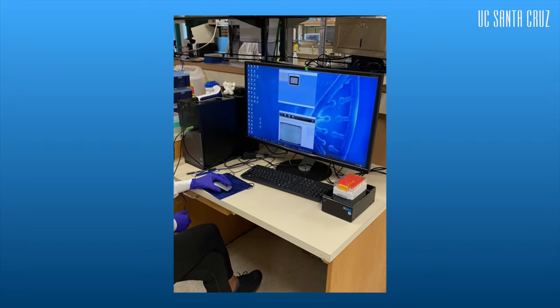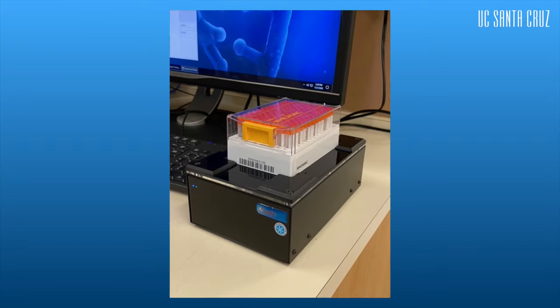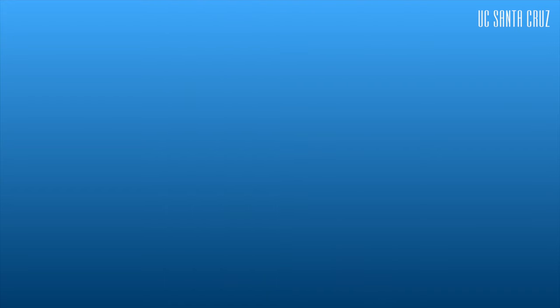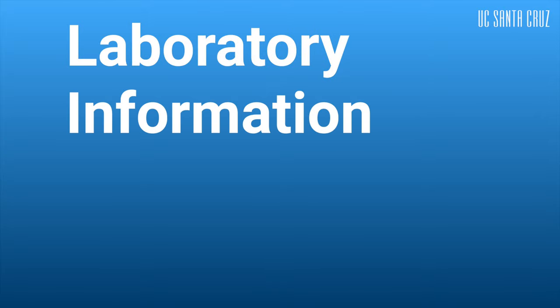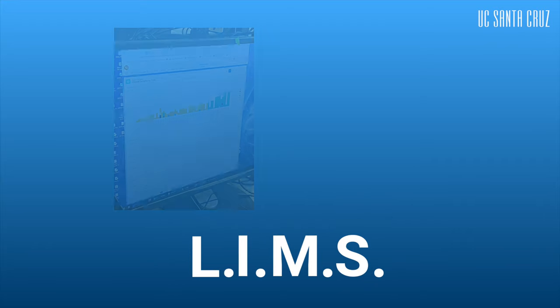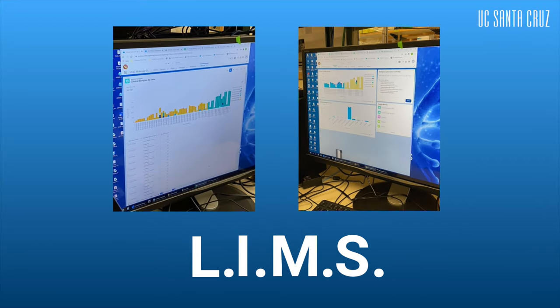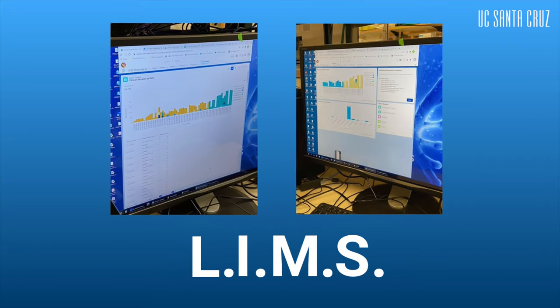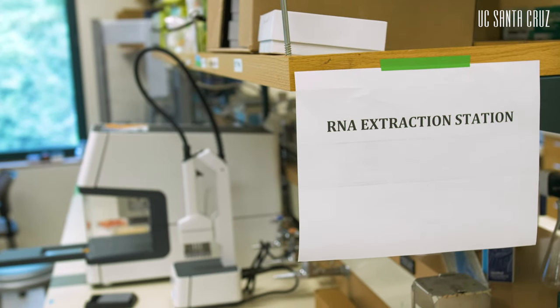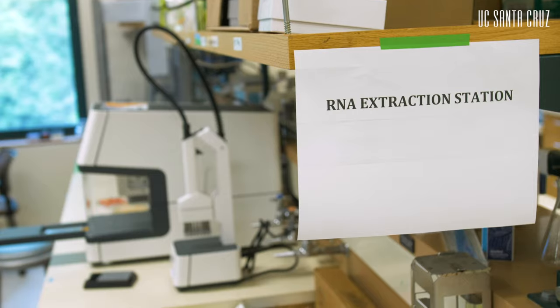Once the kits are sterilized, they are inserted into a barcoded rack, which is placed on a scanner. Up to 96 tubes can be scanned all at once. The scanner automatically registers and uploads their data into our Laboratory Information Management System, also known as the LIMS. The LIMS tracks all samples scanned, checking for personal health information to be sure it matches. Because of this automation, we have been able to scale up in order to process many patient samples all at once.